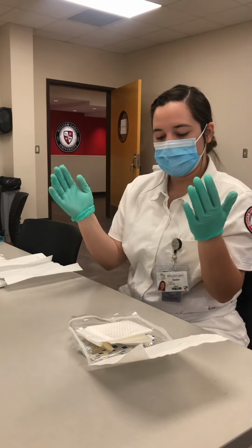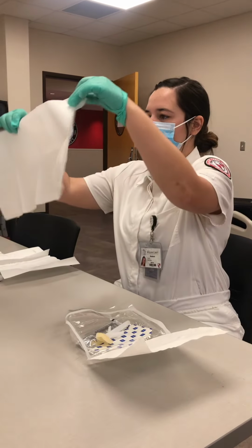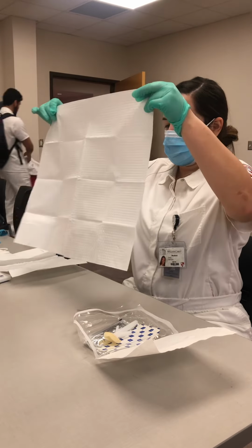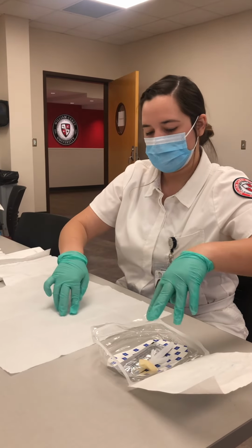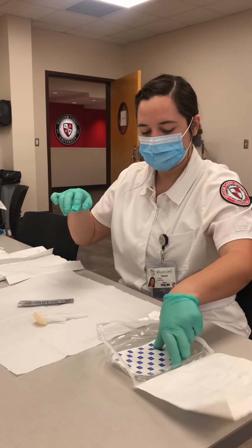We got our sterile gloves, and we're going to take out our drape. I'm putting shiny side down. And now we're going to take our equipment supplies out and put it on the drape.